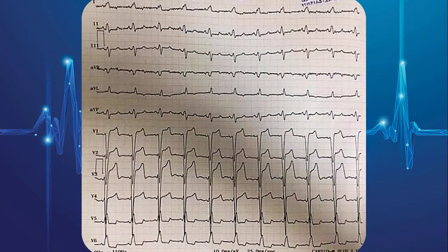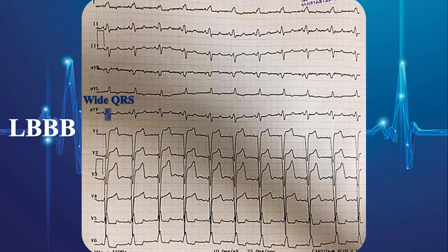This EKG demonstrates left bundle branch block. As you see, the complexes are wide owing to abnormal ventricular activation. There are discordant ST elevations in AVR and V1 to V4. Discordant ST depressions with T-wave inversions are present in lateral leads as well. As we explained, all these STT changes are due to wide QRS complexes.